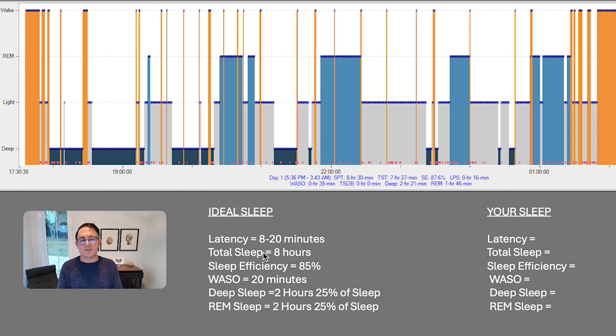There'll be a calculation that measures your amount of time in bed versus how much you slept. That's called your sleep efficiency. That actually changes throughout the lifespan, but in general, we want to say 85% or higher. The younger the person is, the higher this should be, okay?